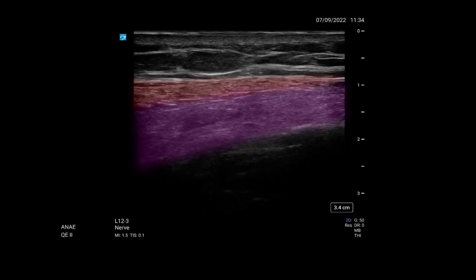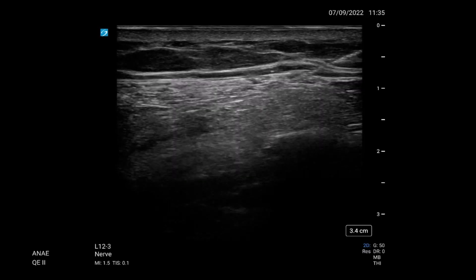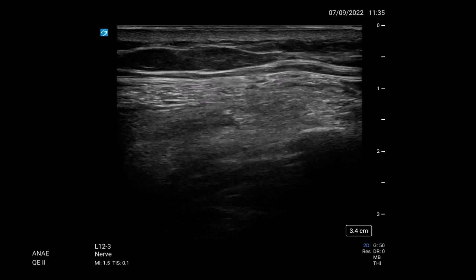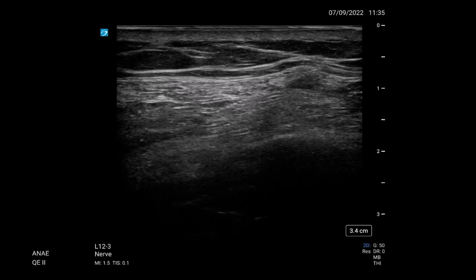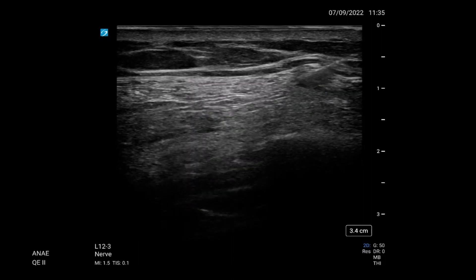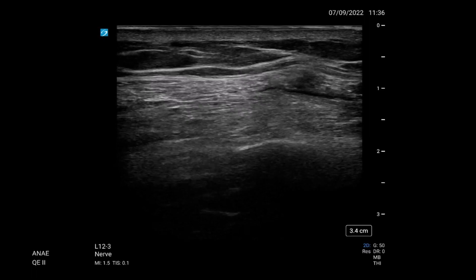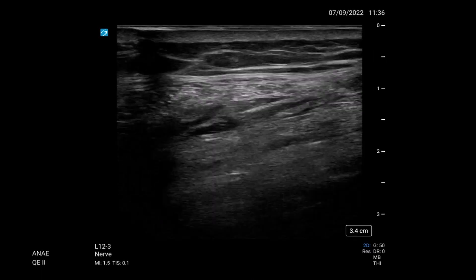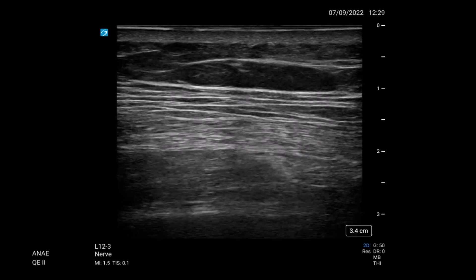Next up we've got another very thin patient. We're going in with a block needle. A little test injection isn't particularly remarkable, so we go a bit further. We're going into muscle and get the sense the fascia is here. I do a lot of little flicking and dynamic scanning off the needle intentionally — just to get a sense of the fascia. Because it's so superficial, often the needle confounds things and it's actually better to be looking off the needle. Gentle injections — you don't want to dump a whole bunch of local in the wrong place. Now we've opened up a little passage. That initial block was for positioning; we've placed a paravertebral and thought we'd do a posterior serratus as well.